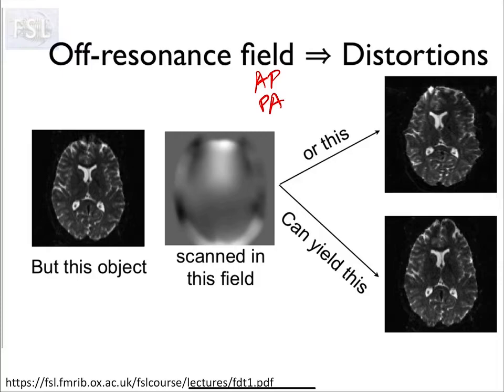So how we traverse Fourier space actually affects the image acquisition. If we go through Fourier space one way, it smushes the front of the head. If we go through the other way, it stretches the front of the head. But they do the same thing. And the fact that it does it in opposite directions is something people figured we could take advantage of.